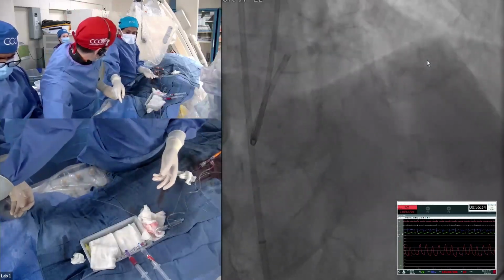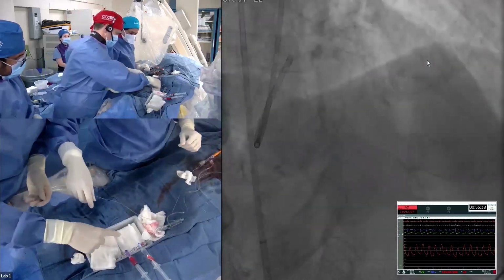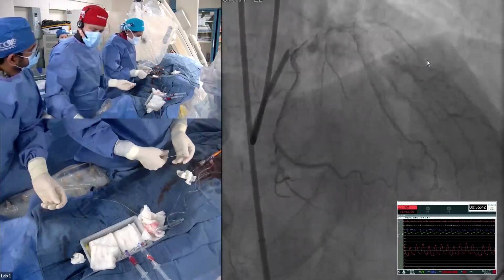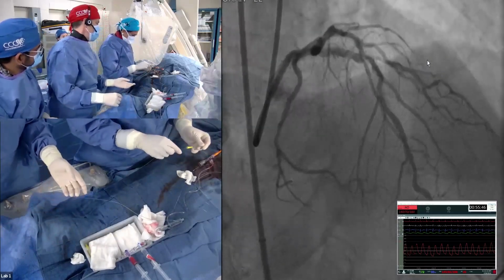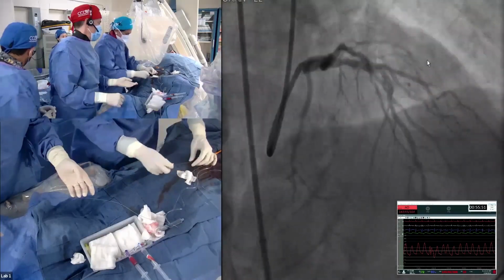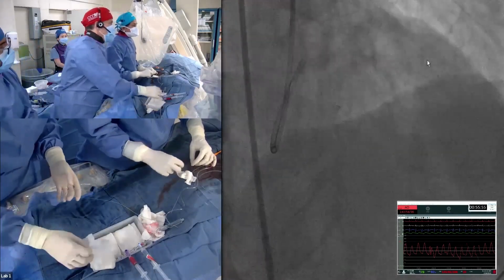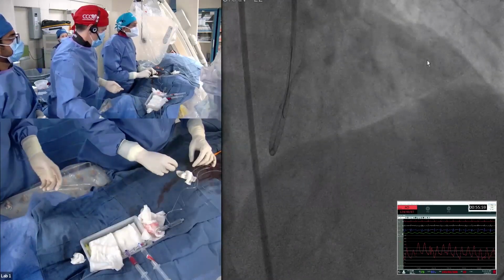I'm with Jazz here. That's an important point. I'm with Jazz here. What about you, John? That's an important point to reemphasize, that with extreme wire bias, you often get a very favorable cut that's almost larger than the burr that you were using to begin with. And that's because it was embedded in the plaque completely and taking out all of that material. So I would agree exactly with my colleague that I think I'm done with atherectomy on the LAD.